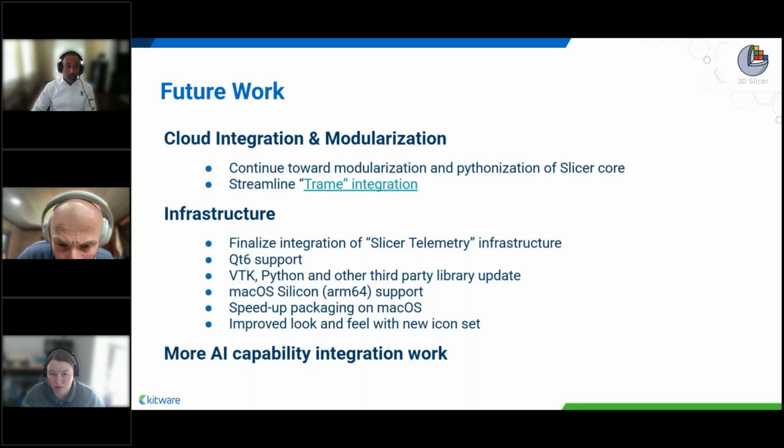Being able to continue to improve some of the interactive AI-assisted tools available within 3D Slicer. And also, 3D Slicer can be used as a front end for data annotation for some federated learning activities that are becoming common in the AI ecosystem. So all these different efforts are going on right now to have a more seamless integration of AI models with 3D Slicer.